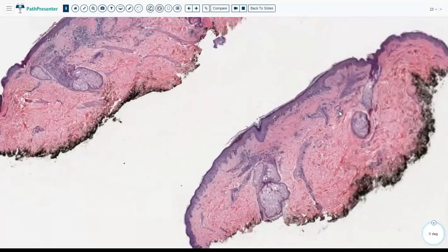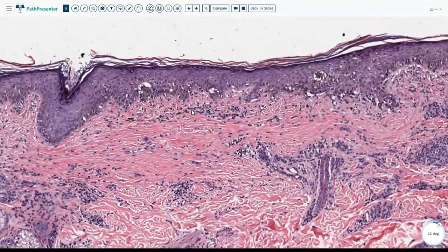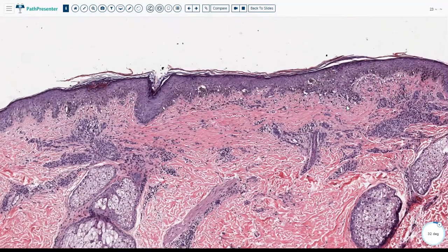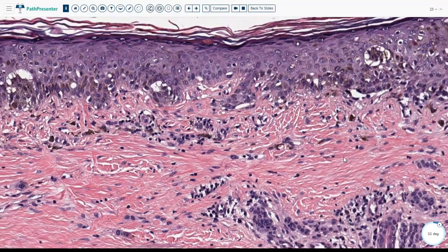An important feature here to be aware of, again, it's a specific situation. If you can see here, this looks like a melanoma. You can see a lot of single cells, pagetoid cells, no nests, nothing. But then what you see below it is a scar, and this is a surgical scar. And this is a recurrent nevus. So I just put this for you to be aware that sometimes the answer does not come from histology as much as it comes from the patient's history. When you see a feature like this, this could definitely be a melanoma. It could be a melanoma with some sclerosis under it for some other reason. But when you see features like this, you should always go back and check the history of the patient, if the patient had a nevus removed in this location before.